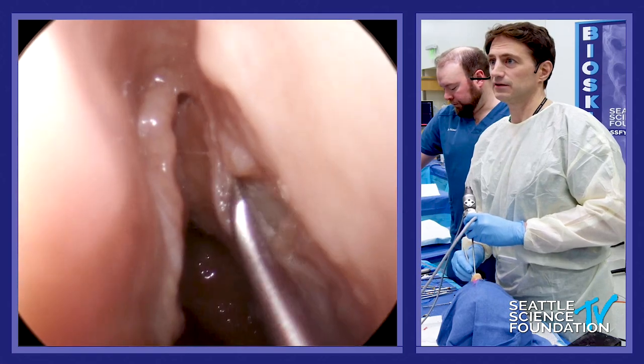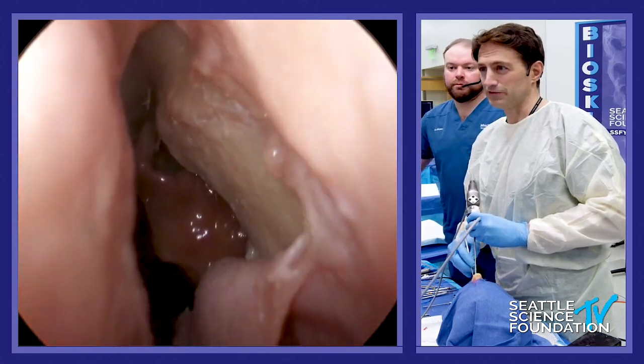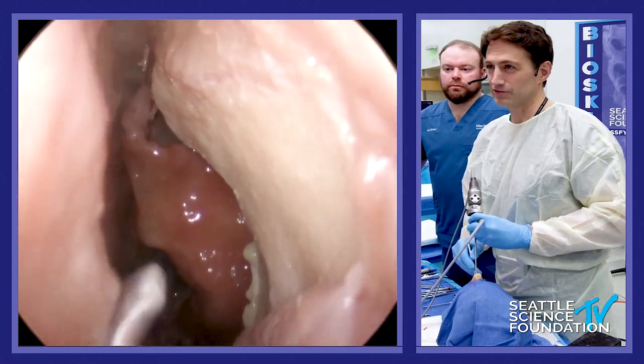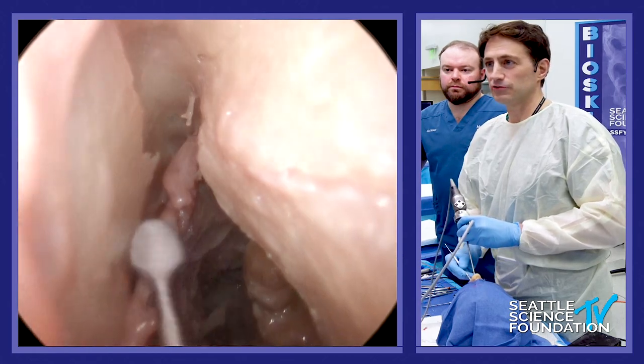Let me show you the flap on this side — here it is. Arif tried to kill it during his dissection. All right, so now we've got both areas really exposed.